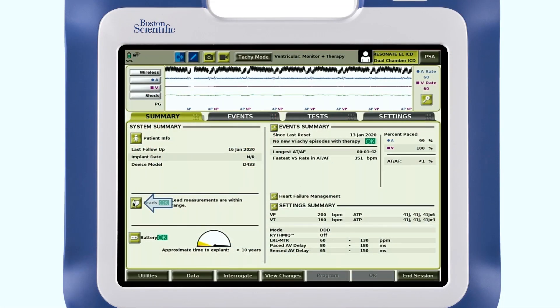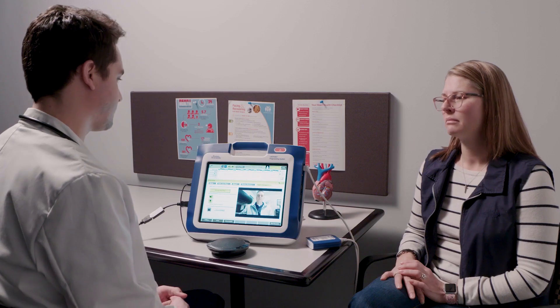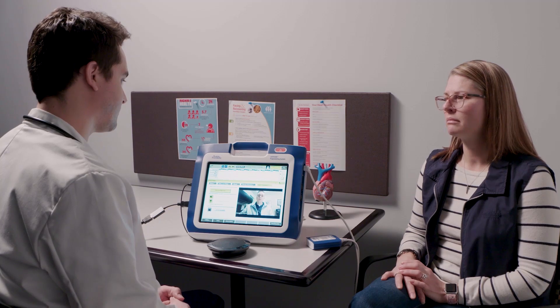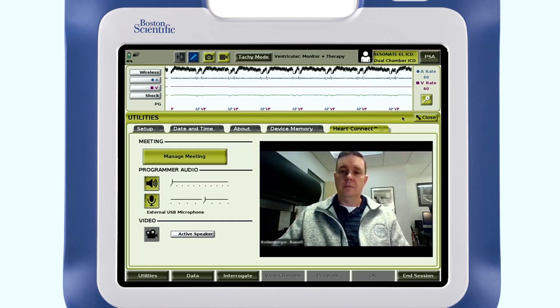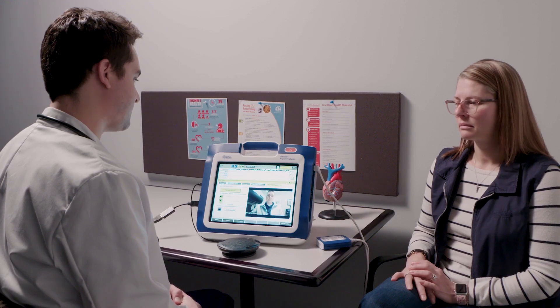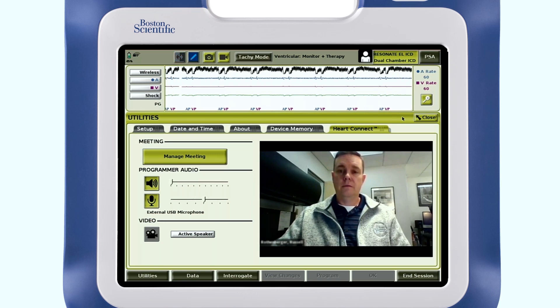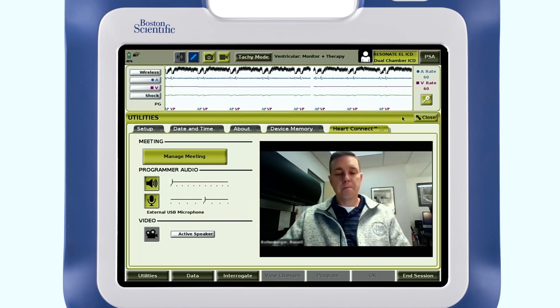Annotations can be made directly on the shared programmer screen by local and remote users. With real-time guidance, the clinician can complete the device check and program as needed. The HeartConnect system streamlines your process by enabling your team to instantly share information on the programmer screen with other healthcare providers and/or Boston Scientific representatives. This video will walk you through the steps to set up and use your HeartConnect system.